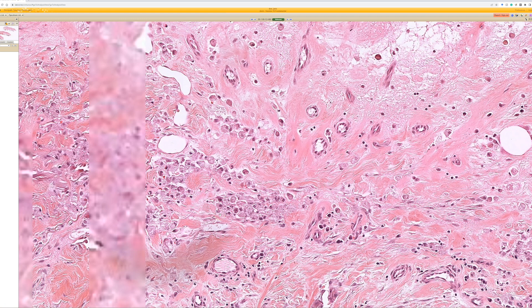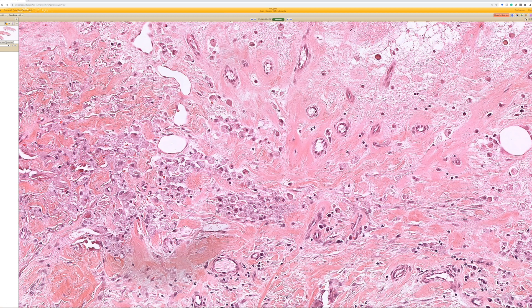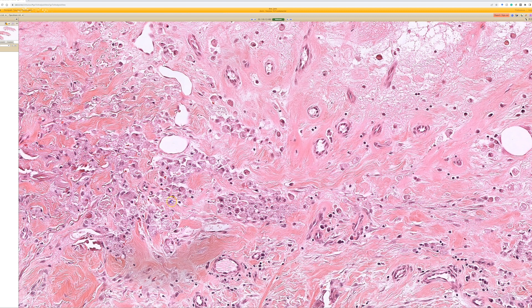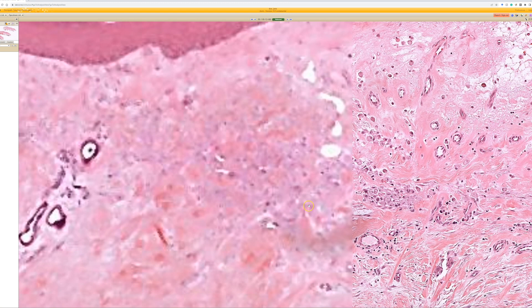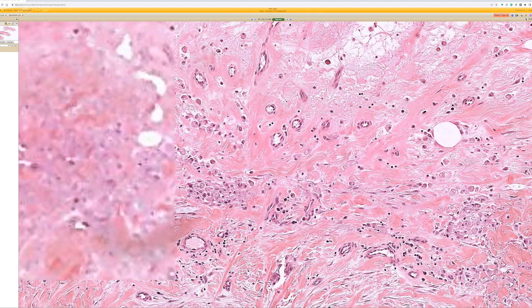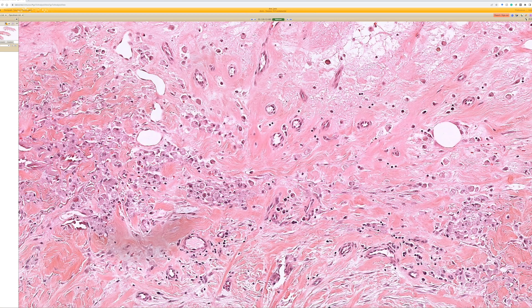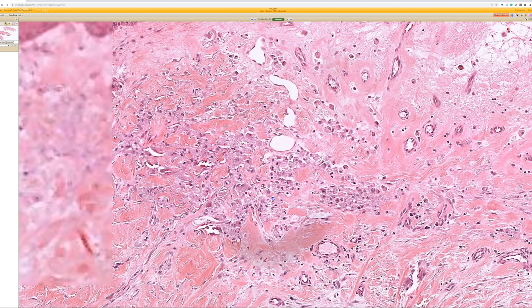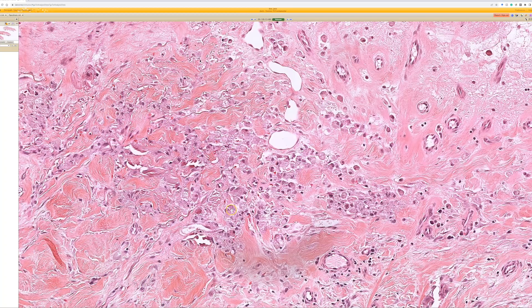This can be really helpful if someone's excising and the biopsy site has healed so well that it's hard to see clinically where the biopsy was done - especially if a patient has many scars. This is yet another great reason why we should always take clinical photographs before biopsies. That photograph can be enormously helpful, potentially increasing patient safety and avoiding legal issues. In cases like that, finding the aluminum chloride can help determine that yes, we do have the biopsy site here.